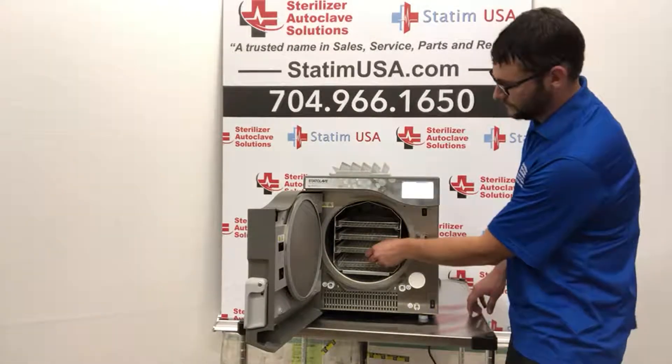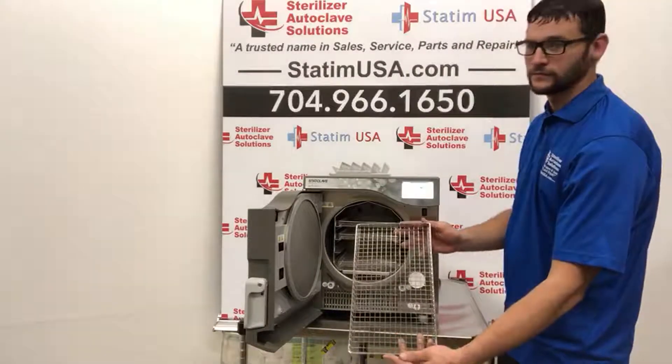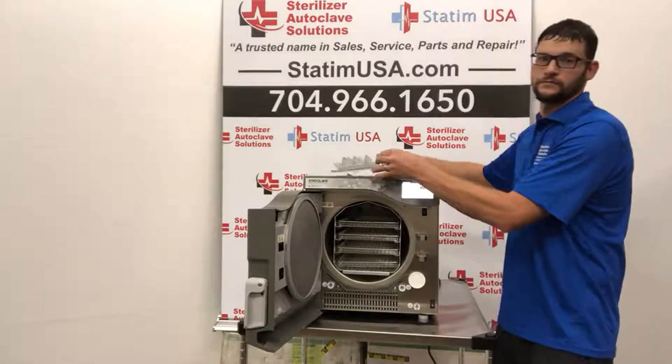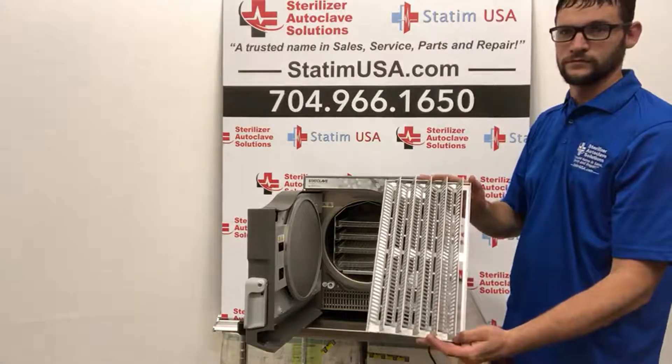As you can see, it comes with four standard autoclave trays, but it also comes with two pouch racks.